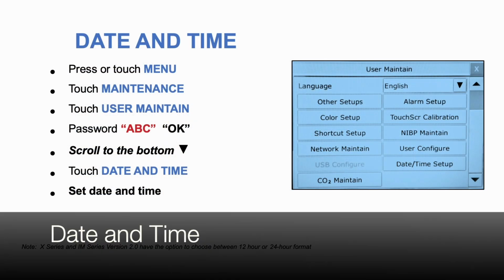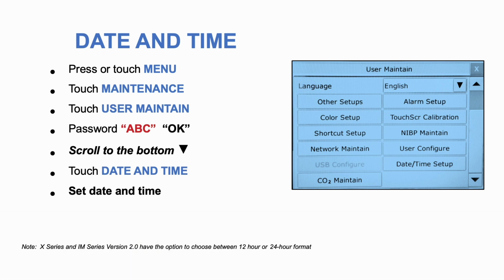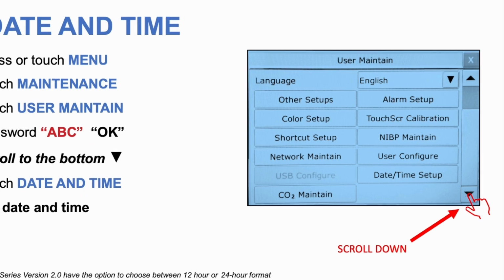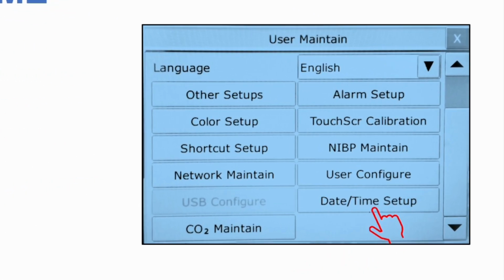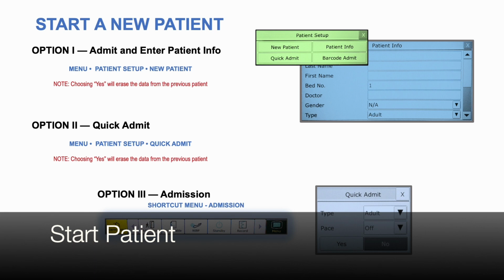Date and time setup. Press or touch Menu, touch Maintenance, touch User Maintain, password ABC, then touch OK. Scroll to the bottom of the screen, touch Date and Time, set the date and time. Note, all X Series monitors and the IM Series version 2.0 have the option to choose between 12-hour and 24-hour format.